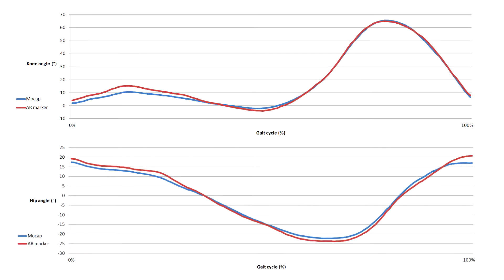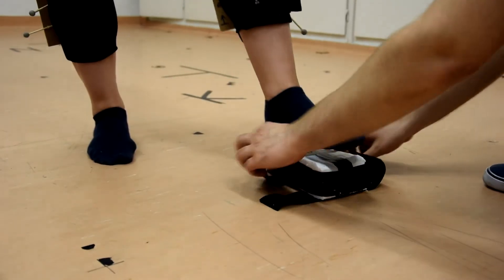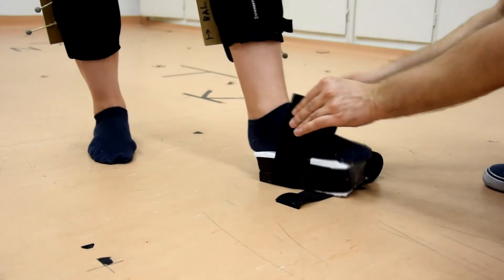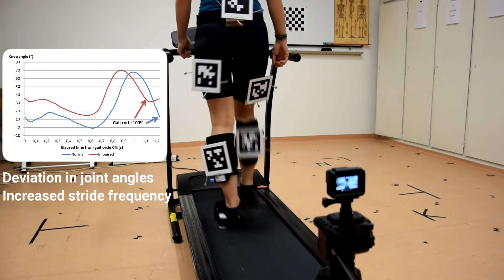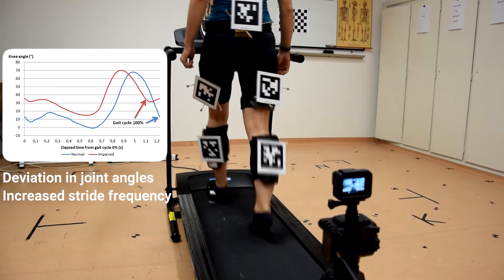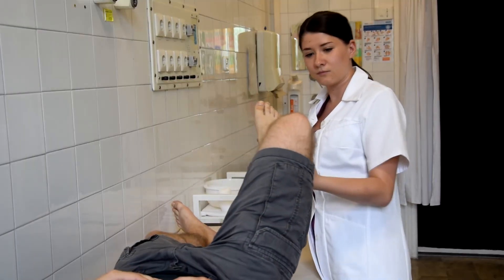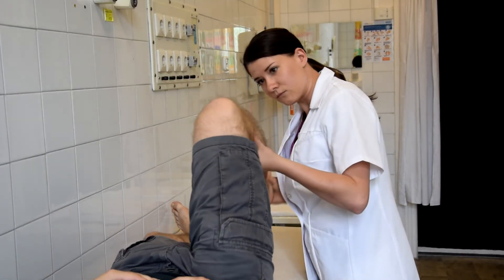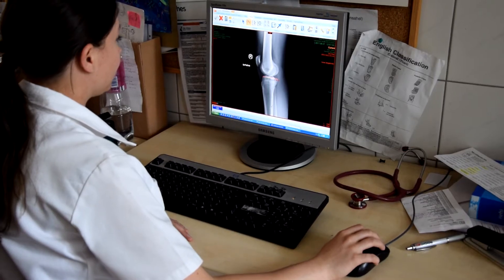Our solution can track highly accurately the joint movement in each dimension. Simulated gait deviations by an elevated foot can also be well detected with our solution. The proposed gait analysis method could be well applied by clinicians, and an affordable gait analysis solution would be very welcome in orthopedic clinics.